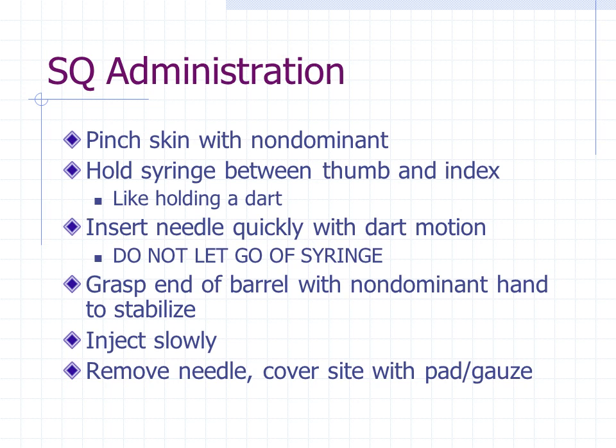Insulin can also be given via an injection pen where you dial up the medication. It has a disposable safety needle that can be attached. You inject and hold for about 10 seconds. These insulin pens are kept refrigerated. With insulin, make sure that you rotate sites to prevent lipohypertrophy or lipoatrophy.